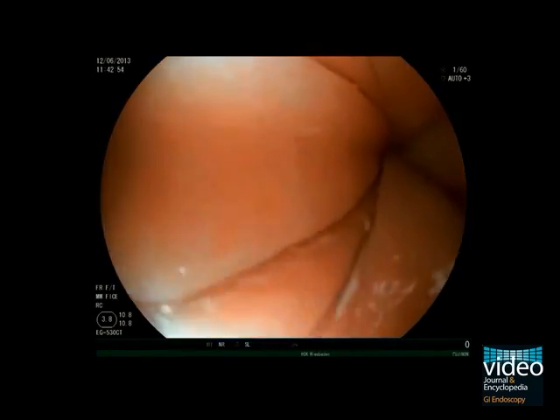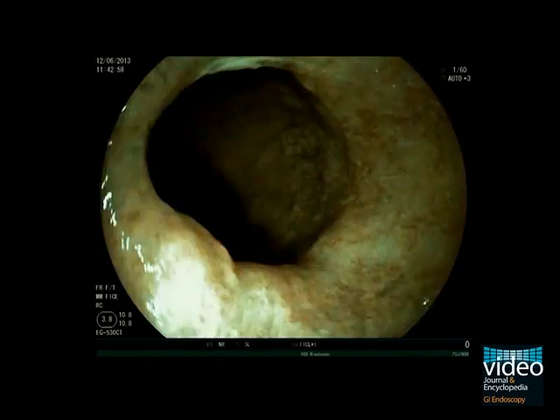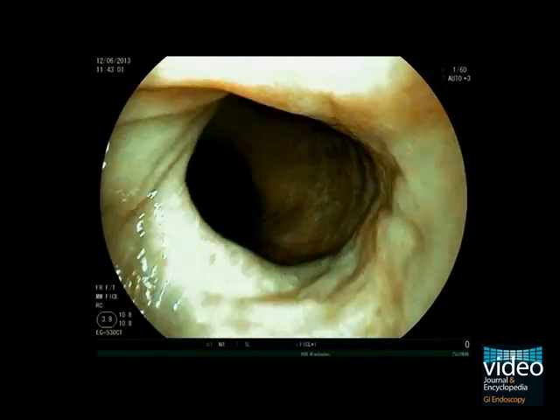In the next step, you should inspect the mucosa for potential dysplasia. Start with white light before using virtual chromoendoscopy.